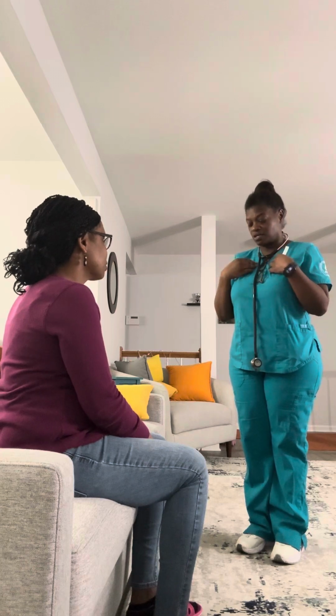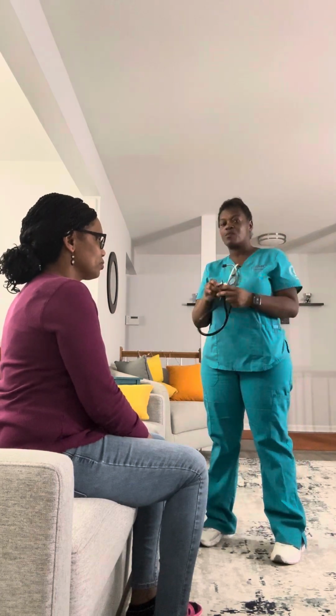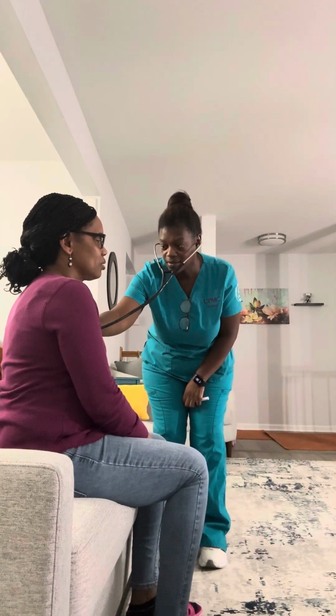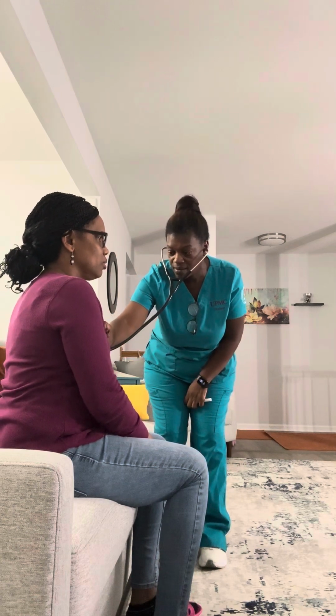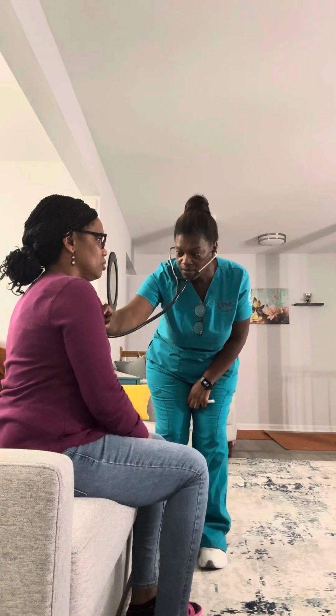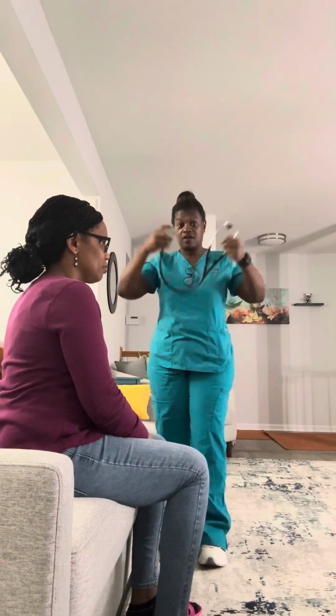So the first thing I'm going to do is just listen to your anterior, which is going to be here, and you're going to feel my stethoscope touch your chest here, okay? Okay. So I'm going to wipe it off with my wipe. And I just want you to take some deep breaths for me, okay? Over on the right side here. Okay, so that's good. Your right lungs are clear, and your left lungs are clear. I didn't hear anything abnormal.